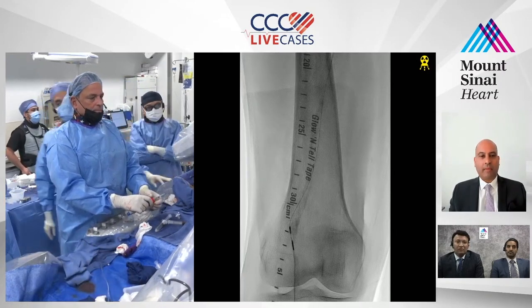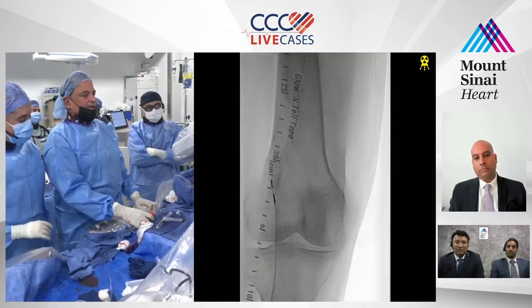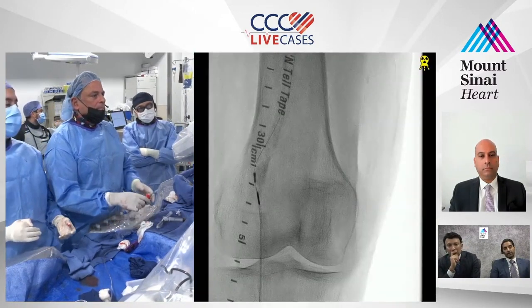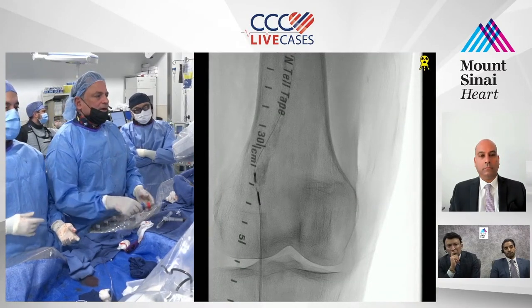Is it getting stuck in the occluded segment, or is this? Yeah. No. In the calcium, not making the calcific bend. So your plan now is to take the second access, like the second port, and just try to wire again. Yeah, approximately, so bare back it. Yeah, exactly. Take the wire, try to get the needle and try to do something here.